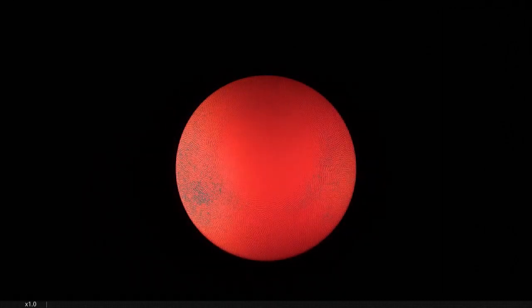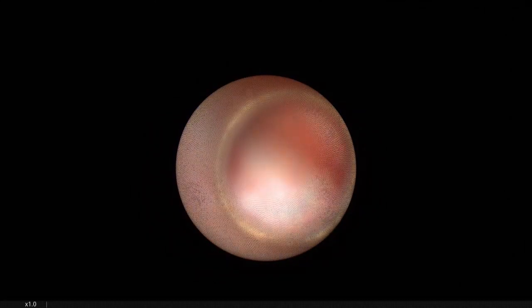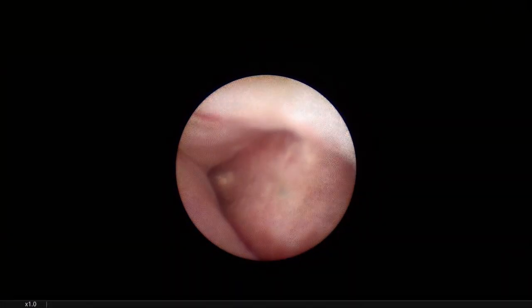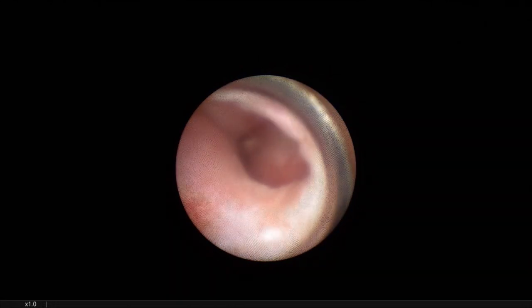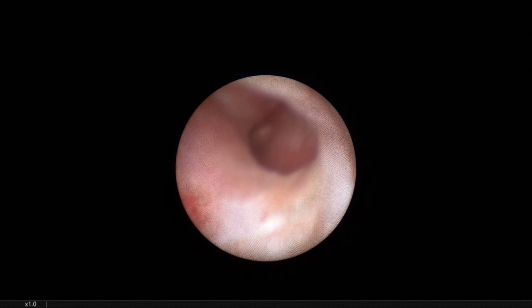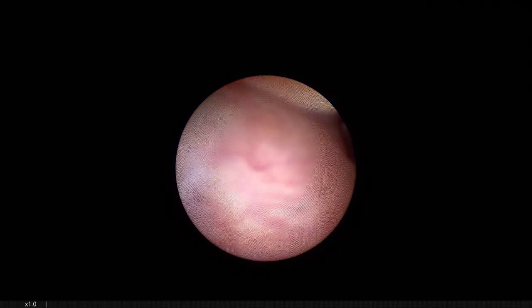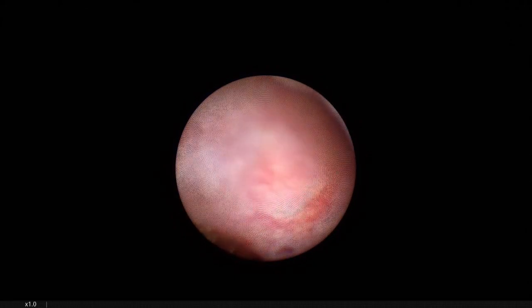This is the UPJ. As this patient was operated on previously, we should expect everything. This is the upper calyx of the lower calyceal stone. We are in the lower calyx. This is the upper one of the lower calyx. Yes, here is the stone.